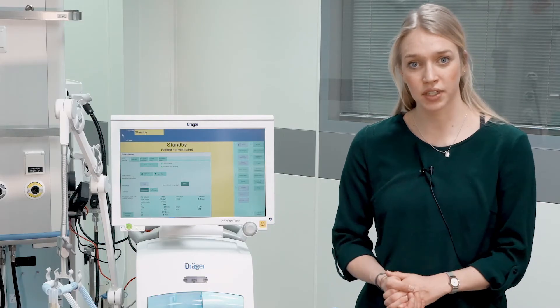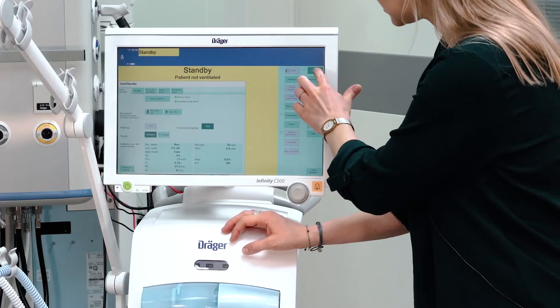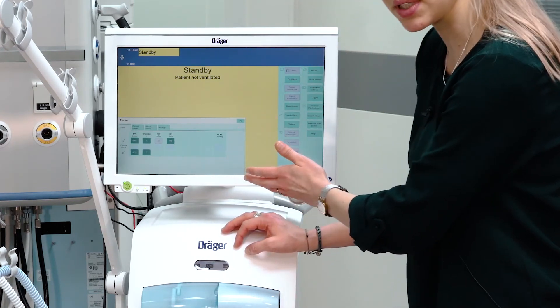Before starting ventilation therapy, make sure that the alarm limits are set for your patient individually. Please select the menu Alarms and make sure that the alarm limits are correctly set.